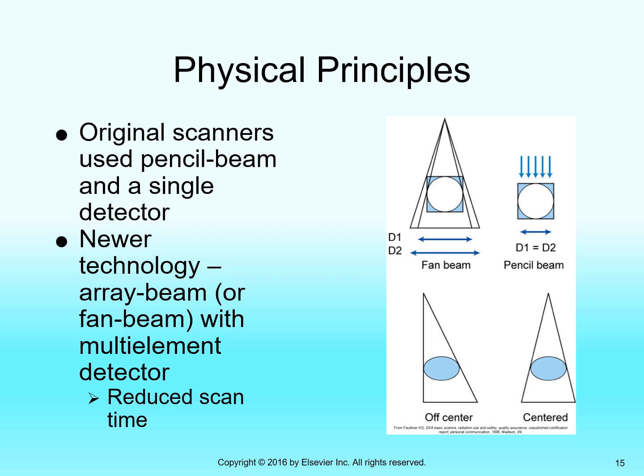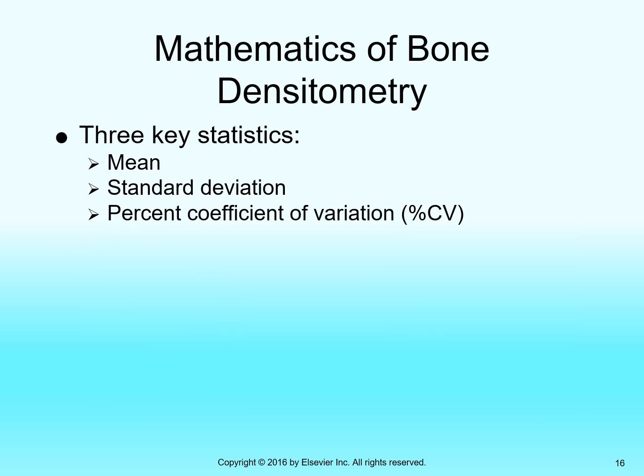By that I mean an accurate score of what is this patient's actual calcium content of their bones. That's the real trick with a quality bone densitometry scan: when we calculate and publish this measurement, does it reflect the truth? And so that's where we get into the statistics.